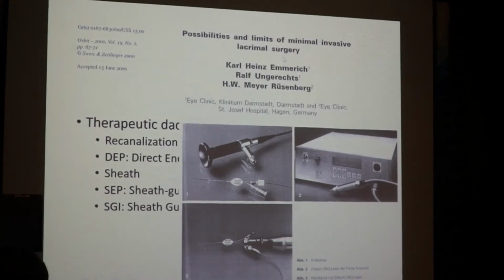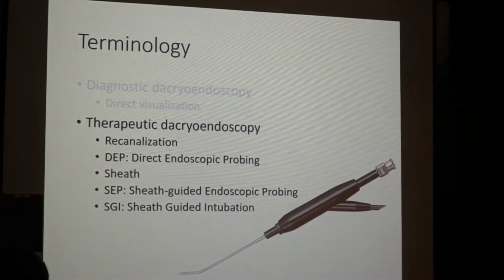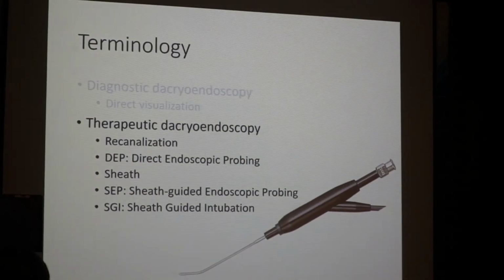However, without using such a special device, we can perform the same minimally invasive lacrimal surgery using a fiber-type lacrimal endoscope with some kind of simple device or simple technique. I'll let you know several techniques and devices.